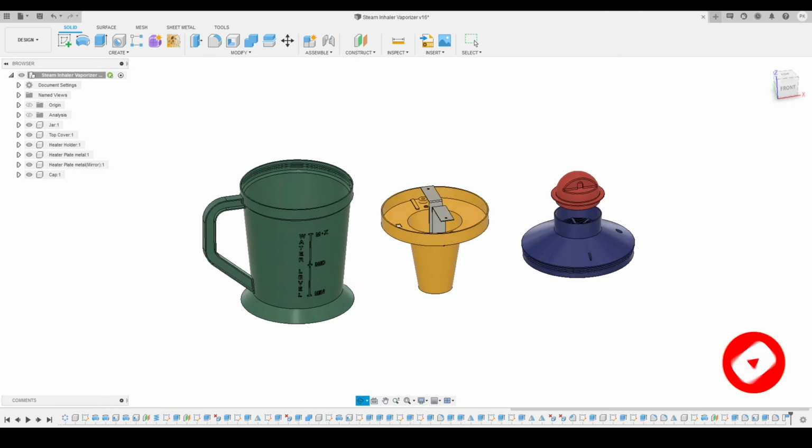So what I can do, I can just turn on the origin to see if it is aligned with the origin. If it is not, I can just click on edit canvas over here, and I will move it a little bit to align it with the origin. So here you can see, and we'll press OK. Here you can see the work of this canvas is over for now.